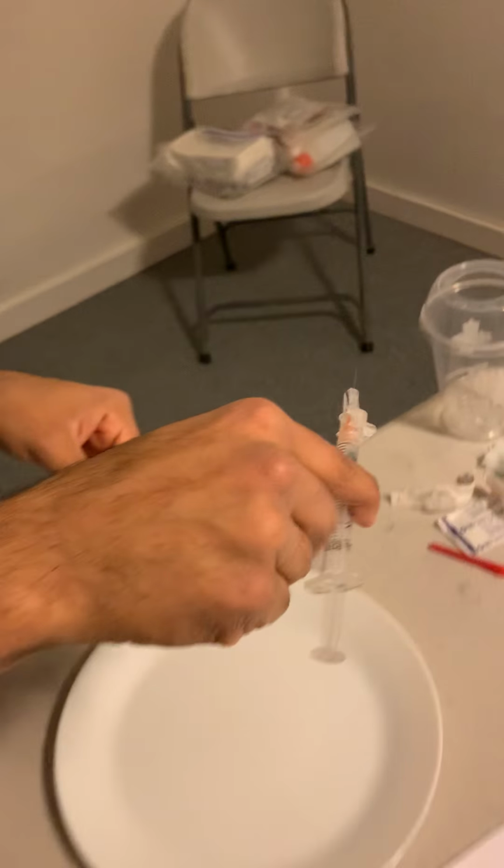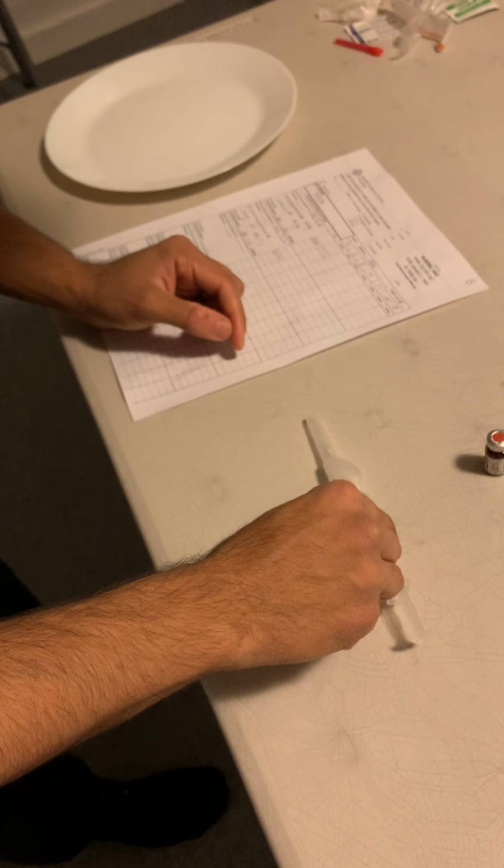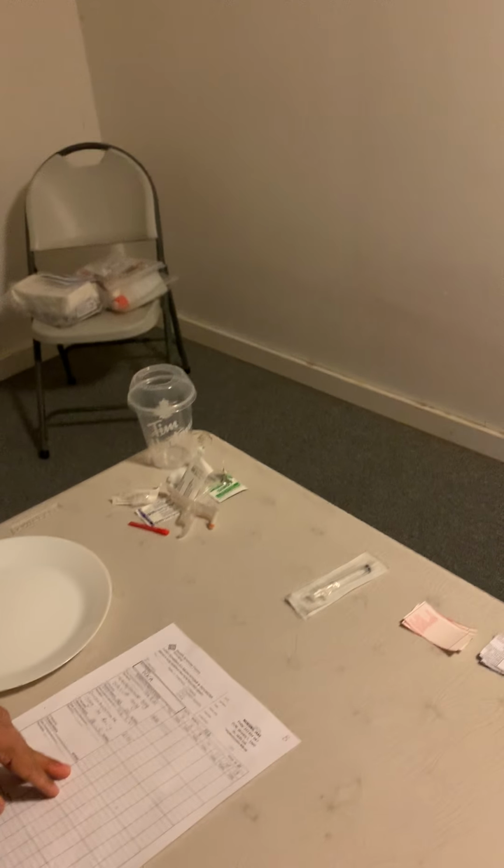Okay, I have 1 ml over here, which is my desired dose. I'm going to be scooping that, capping it, and this is 1 ml. You can check it.